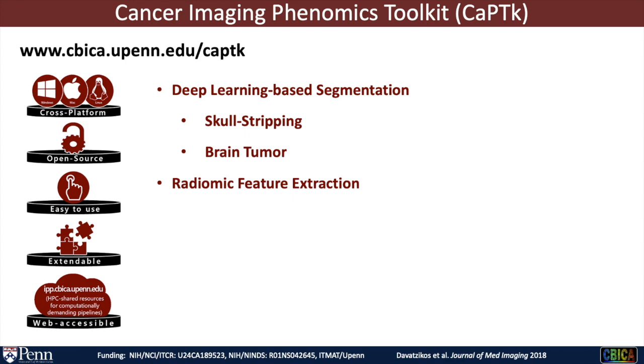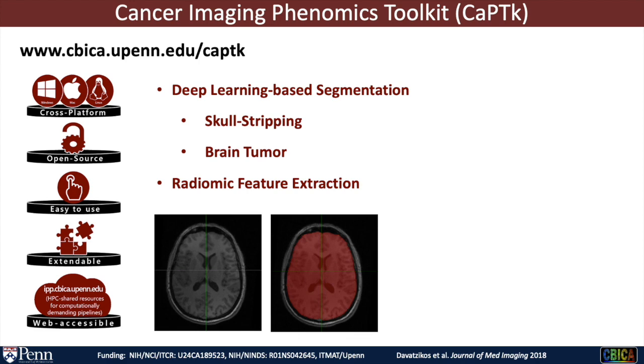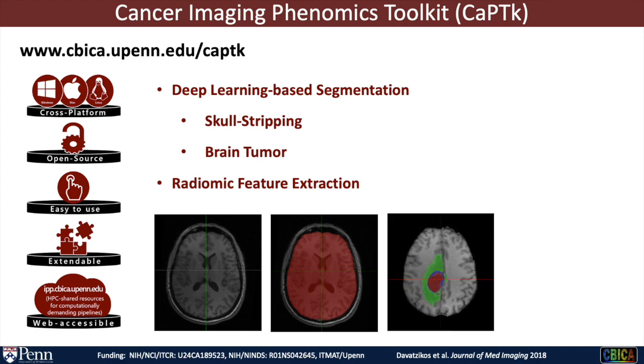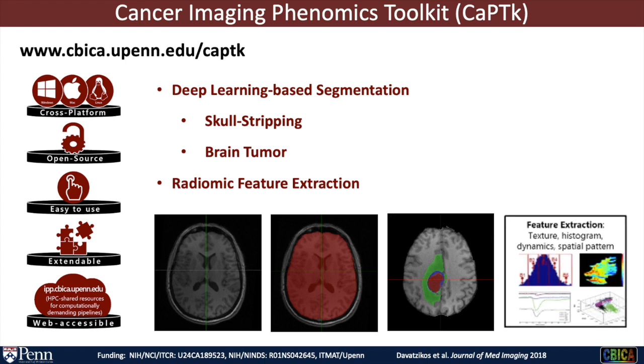Here, for the deep learning-based segmentations, I will be demonstrating the segmenting of the brain for skull stripping, as well as segmenting of the brain tumor. At the end, I will briefly show how you can use these segmentations to extract radiomic features in your regions of interest.